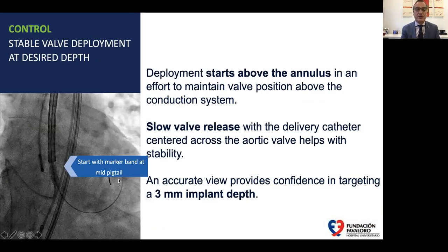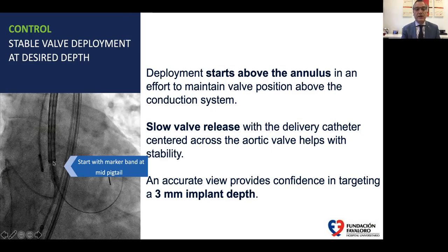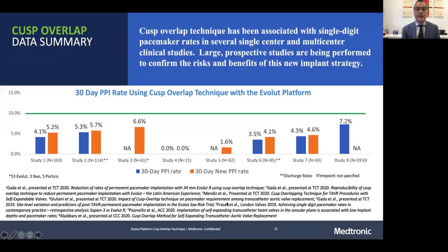This technique has another key feature: we start deployment of the valve above the annulus, as shown here. This is the pigtail in the aorta, this is the plane of the annulus, and here is the tip of the valve in the catheter of the delivery system. We start the implantation here and allow the valve to dive into the LVOT approximately three millimeters below the annulus for a very shallow implantation.